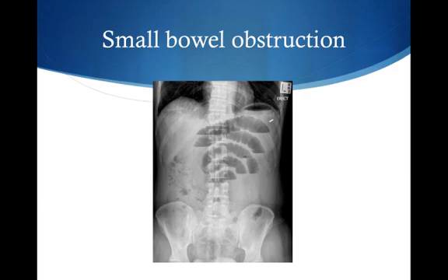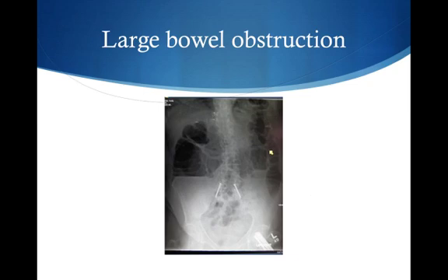Here are a couple of quick examples of abdominal radiographs. This is a KUB of a small bowel obstruction. You can see this is an erect patient sitting upright, so the air fluid levels in the small bowel are very clearly visible, indicating an obstruction distal to these levels. The stomach in the upper left quadrant is a normal finding, but air fluid levels in the small bowel are abnormal. This next one is a large bowel obstruction, very similar to a small bowel but a bit larger, and the location helps determine where the obstruction occurred.